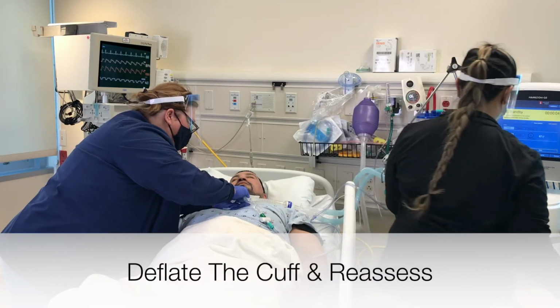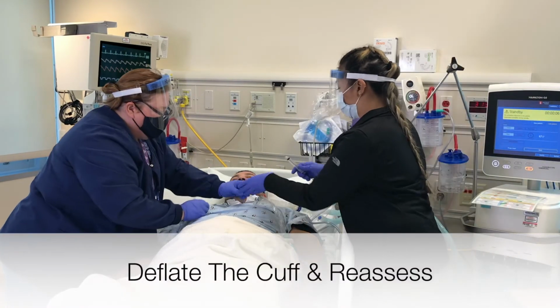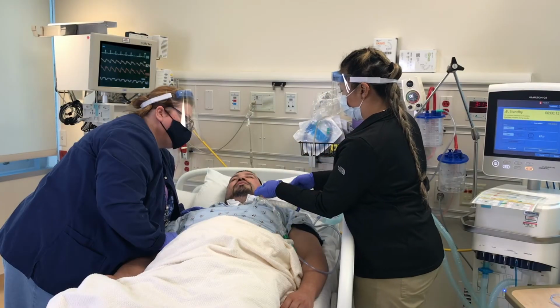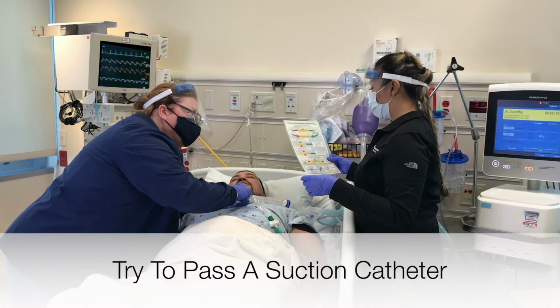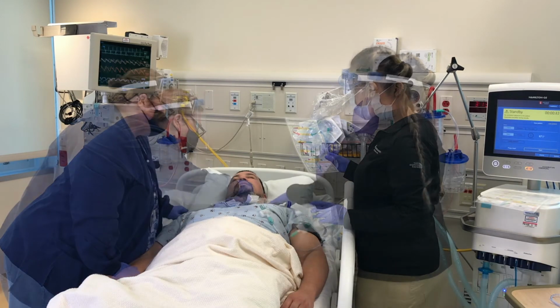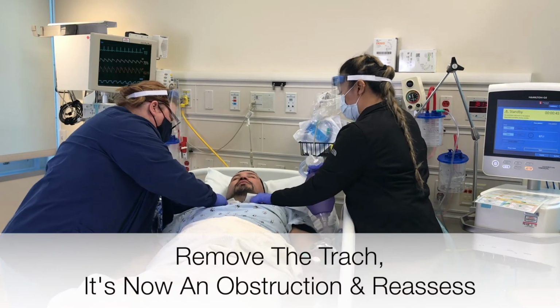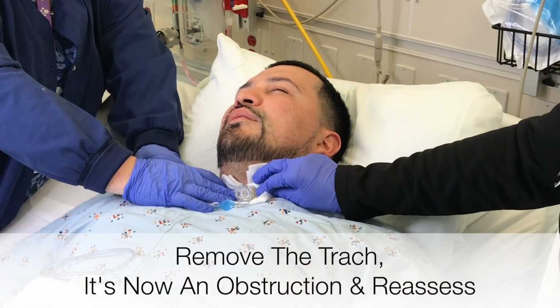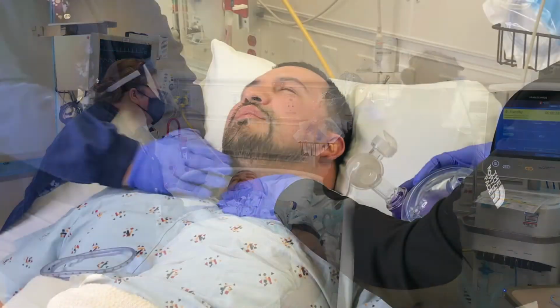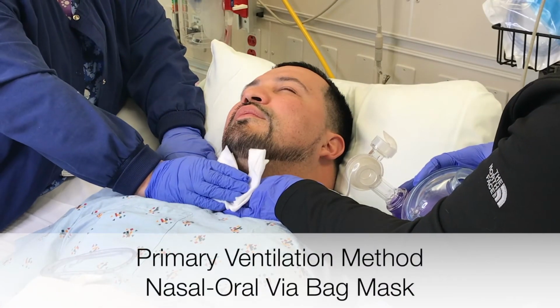Let's deflate his cuff. Cuff is deflated. Should I try and pass again? Yeah, see if you can pass one more time. It still won't go. Straight, because if it's occluded, then I don't think it's working. So let's see if we can take it out. Okay, let's go see if we can ventilate him from the mouth.